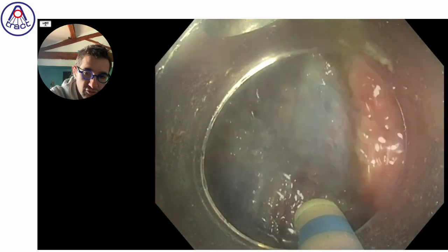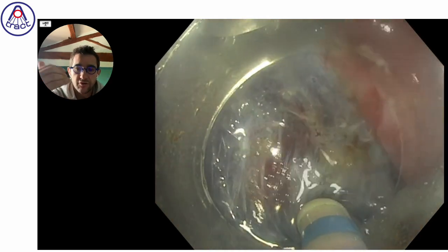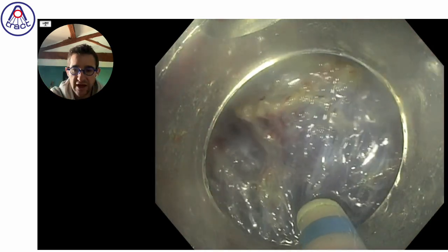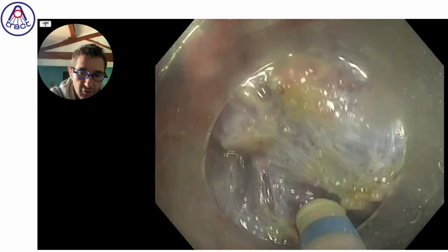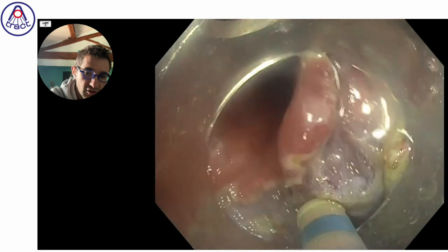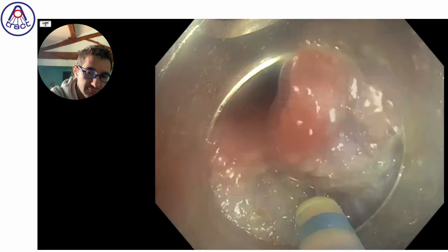So thanks to this kind of flat anal to oral dissection with a large cutting line, you can treat a large surface for every movement and not go back to an area several times.